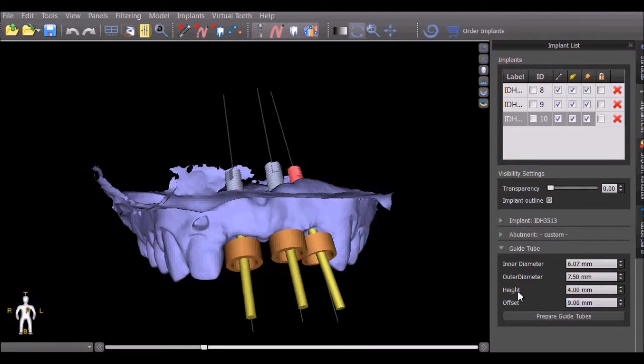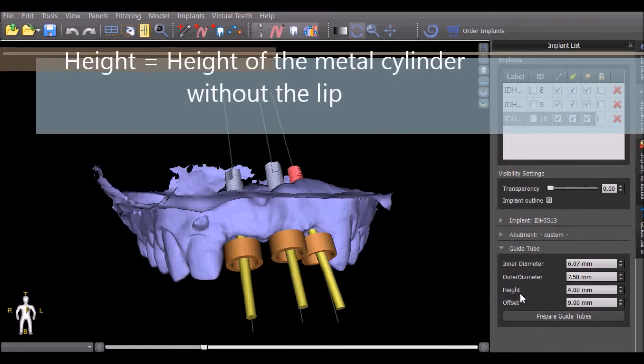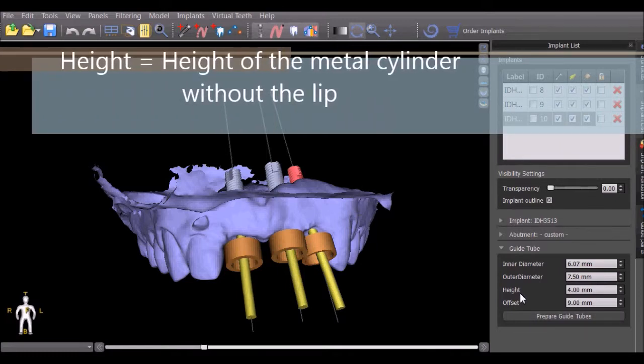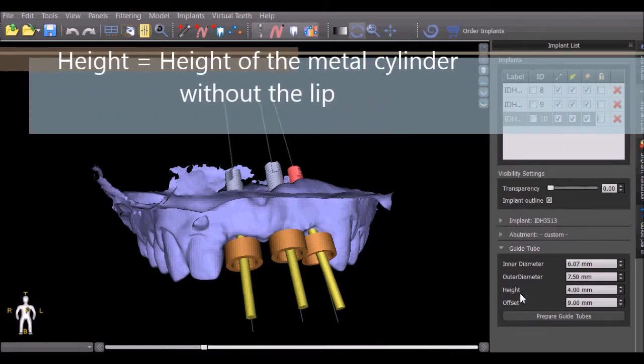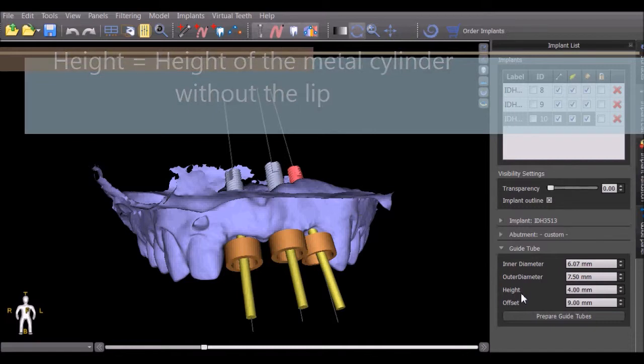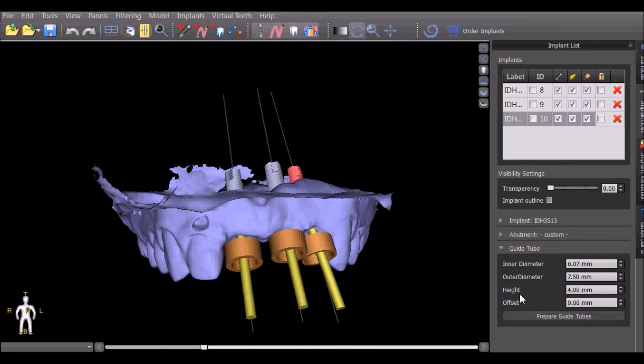The height of the guide tube should be set to match the height of the metal cylinder minus any lip that the metal cylinder might have. For example, if a 5 mm metal cylinder is going to be placed into the surgical guide but the top 1 mm is a lip, then the height of the guide tube should be set to 4 mm.